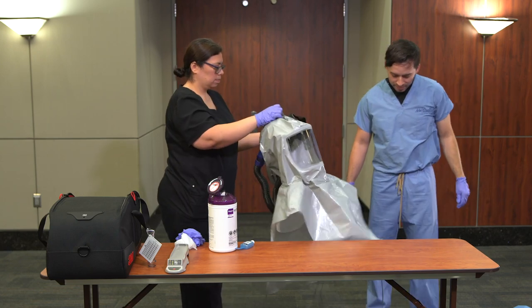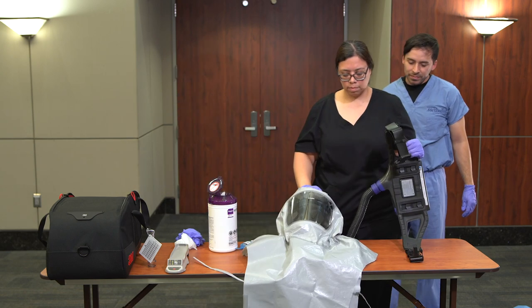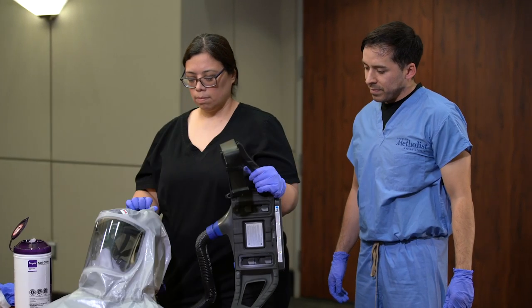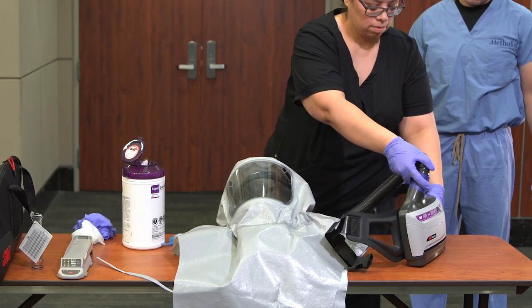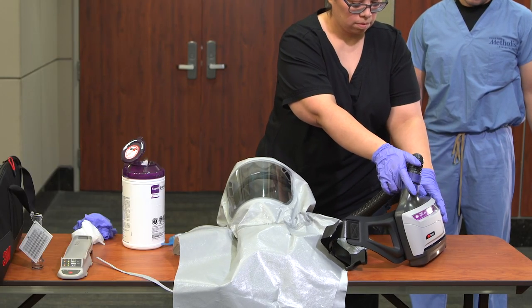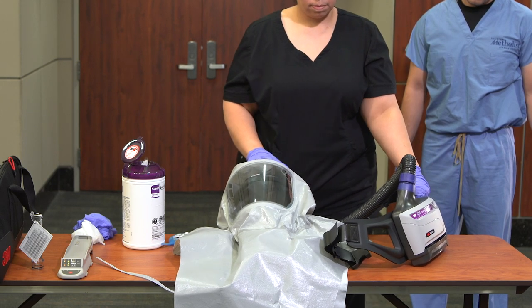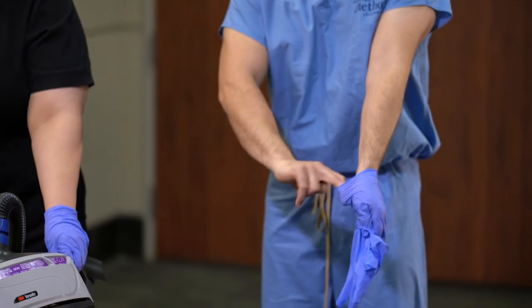Hand the head cover to the buddy. While holding the blower assembly with one hand, the buddy should grab the head cover from the caregiver. The device should remain on during this process. The buddy should place the contaminated shroud and hood on a table and turn off the blower assembly. The caregiver should then remove their gloves using glove-to-glove, skin-to-skin technique, and perform hand hygiene.